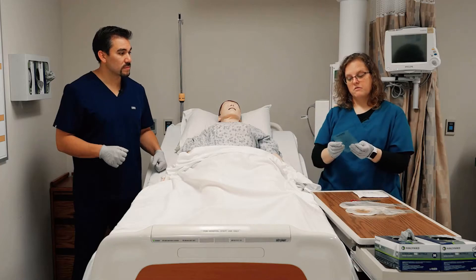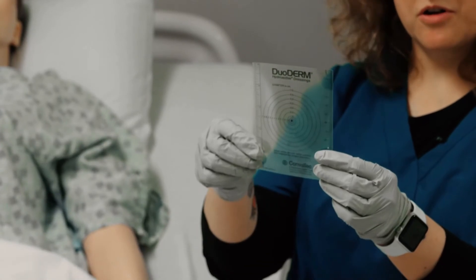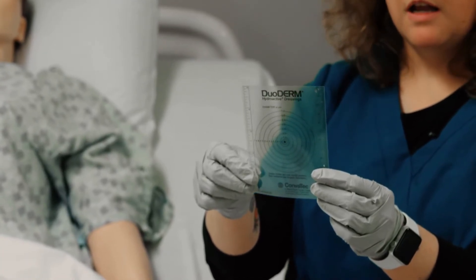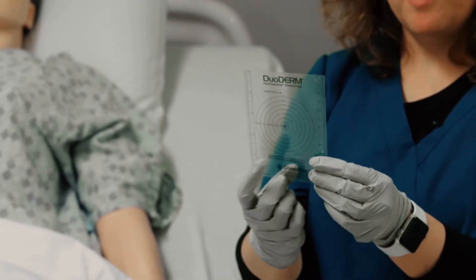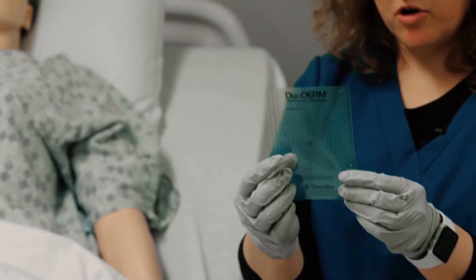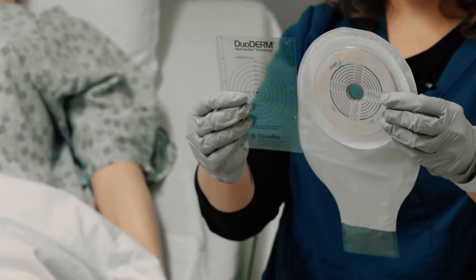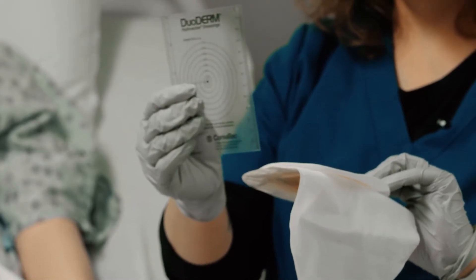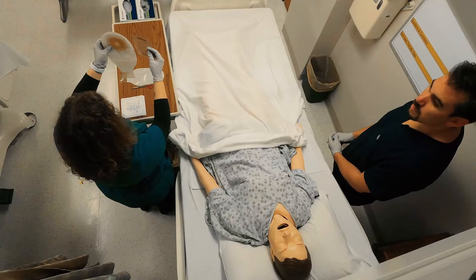To measure your ostomy — and this is standard wound measurement, so this tool should look familiar — you've got inches on one side, centimeters on the other, and the part we're really interested in for the stoma is the centimeter diameter in the middle. This one has inches and millimeters with various measurements all the way around.